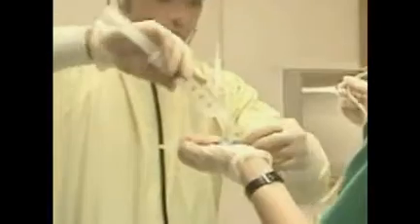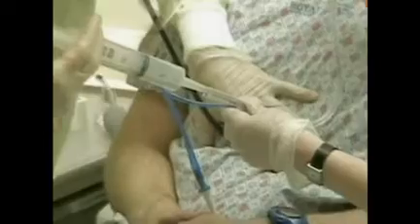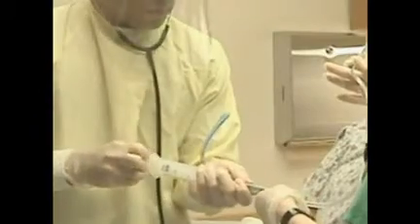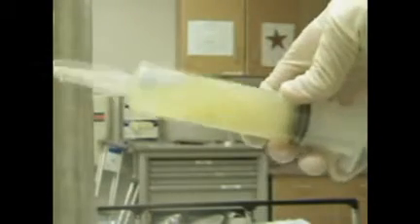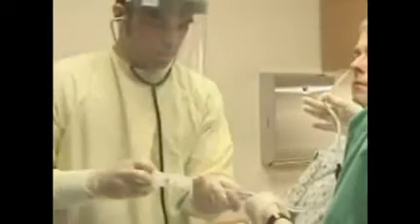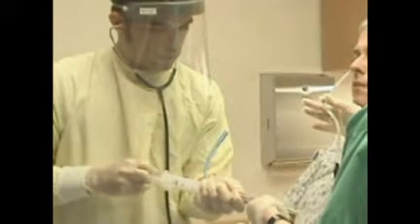Attach the catheter tip syringe to the main port of the NG tube and insufflate 30 cc's of air while auscultating over the epigastrium. A gurgling noise should be clearly audible. Using the same syringe, aspirate the NG tube and ensure that it fills with gastric contents. It should be noted that auscultation and aspiration may occasionally provide false positive results.